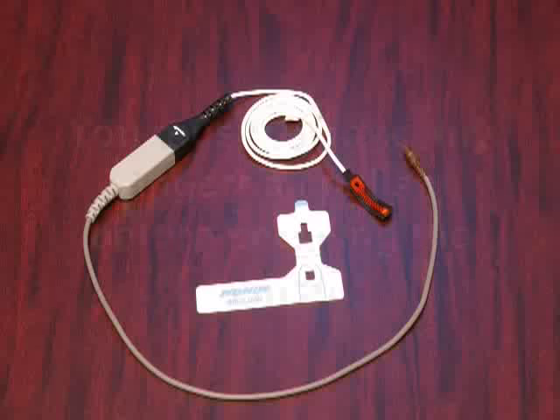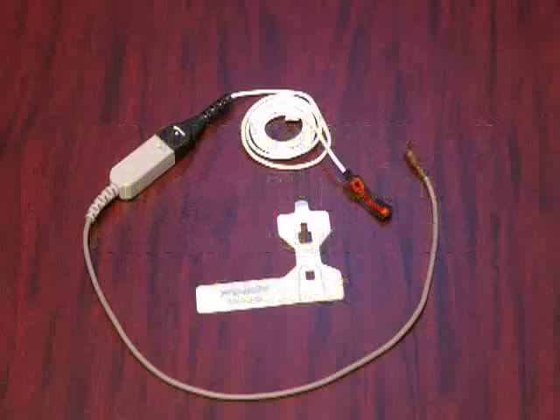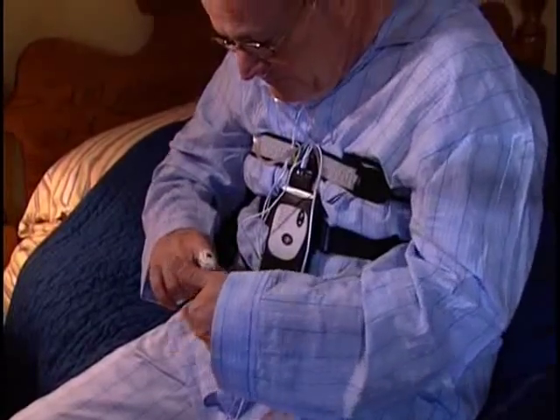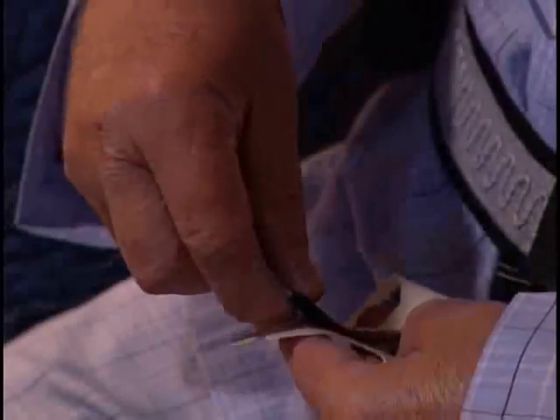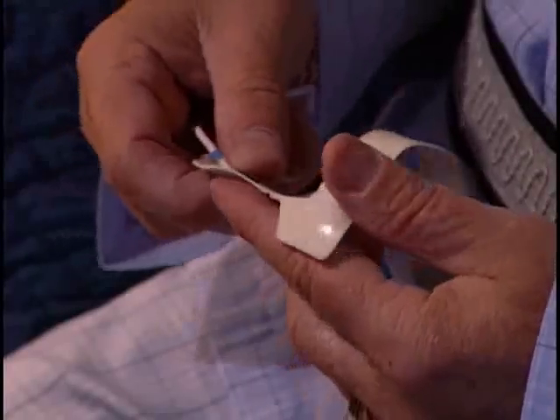To monitor your oxygen level accurately, you must remove any polish from your fingernail before securing the sensor. Place the oximeter on your index finger. The preferred application side of the oximeter is the index finger. Grasp the blue tab on the oximeter finger wrap. Peel the paper backing away. Firmly press the sensor against the adhesive side of the finger wrap.